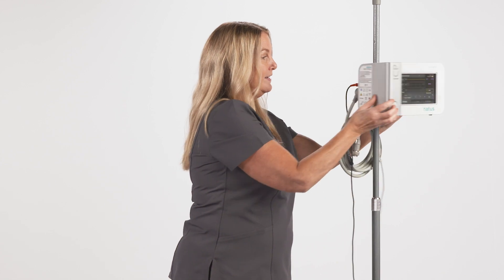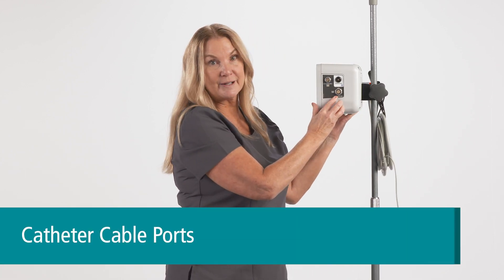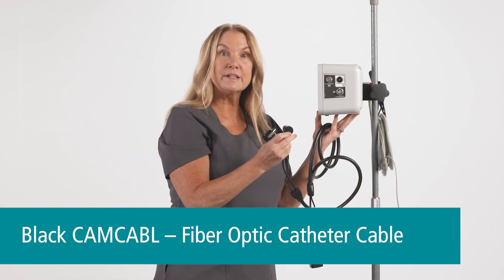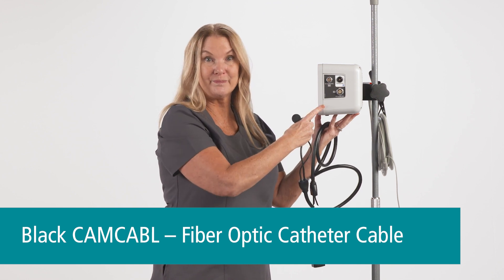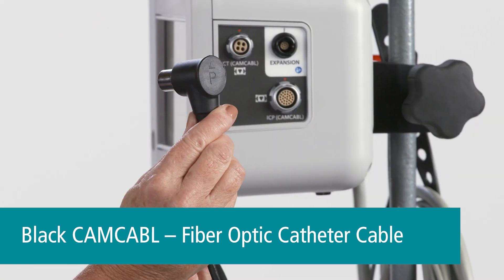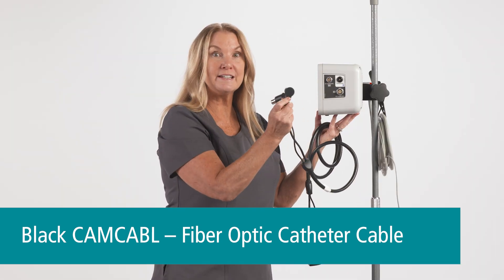If I turn the Camino on the side, you'll see this black area. This is where the cam cable is attached. The cam cable connects the 110-4 series fiber optic catheters to the monitor. On the cam cable, you can see that one of the connectors says P for pressure and the other one says T for temperature.